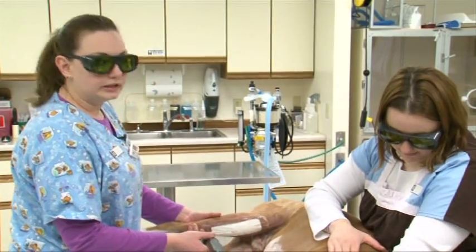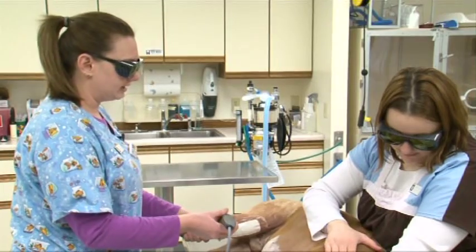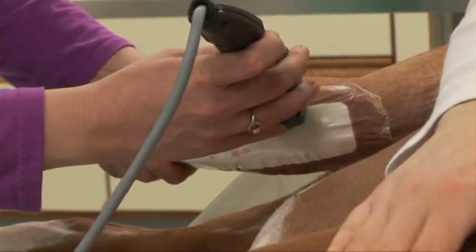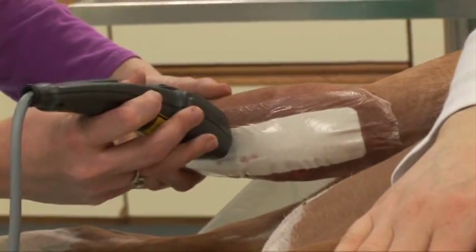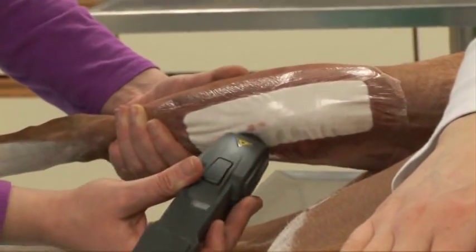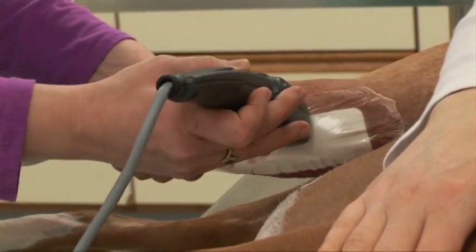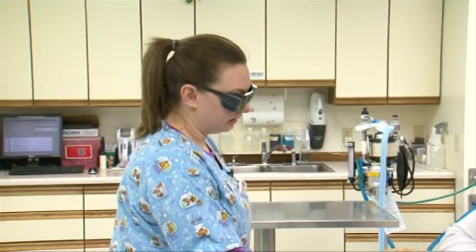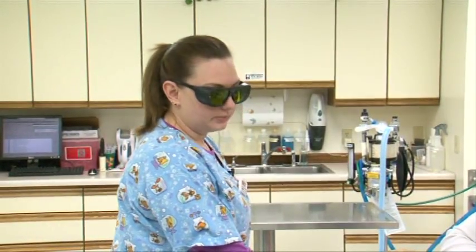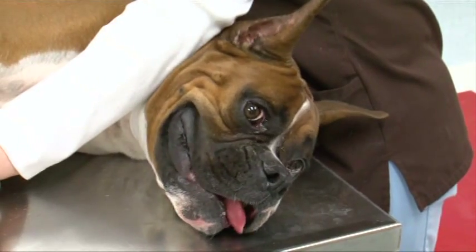This will also help with swelling and it will help get the blood flow moving so he's less painful. With point-to-point, you get six different spots about two centimeters away from each other and they're on each side. You just press this button and it starts beeping. It's not painful for the patients and most of the time they just lay there and let you do what you need to do for the treatment.